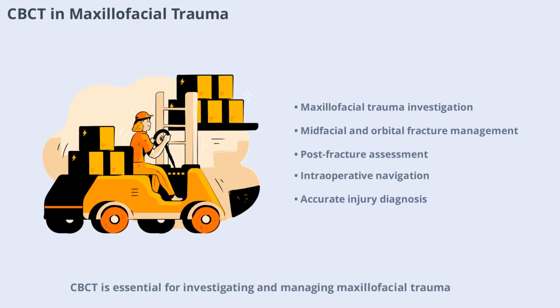CBCT is essential for investigating and managing maxillofacial trauma, especially midfacial and orbital fractures. It allows for post-fracture assessment and intraoperative navigation, ensuring accurate diagnosis and effective management of complex injuries.